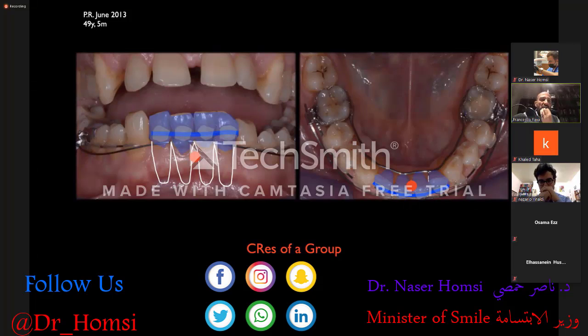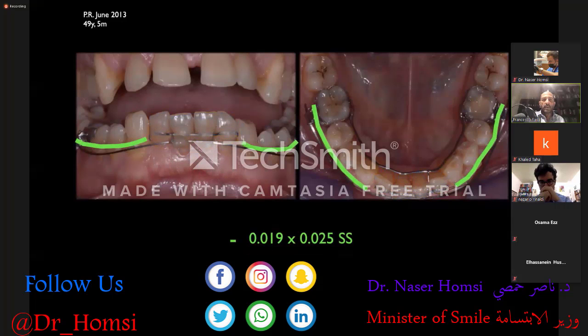So we are now discharging the intrusion forces on a block of teeth consisting of all four incisors soundly connected together. The incisors are intruded, discharging the reaction forces on a posterior block of teeth created by using a 19x25 stainless steel wire on the first molar, then second premolar, and canine as well, connected together. The 19x25 stainless steel wire is bonded with flowable resin to the enamel of the corresponding teeth.